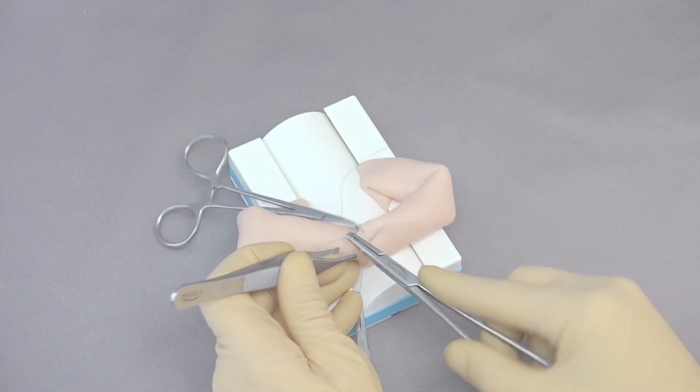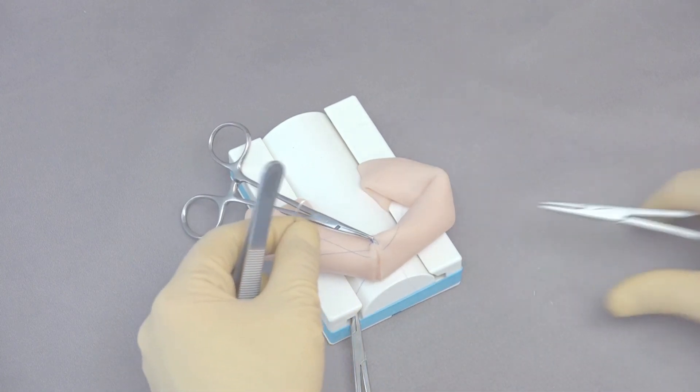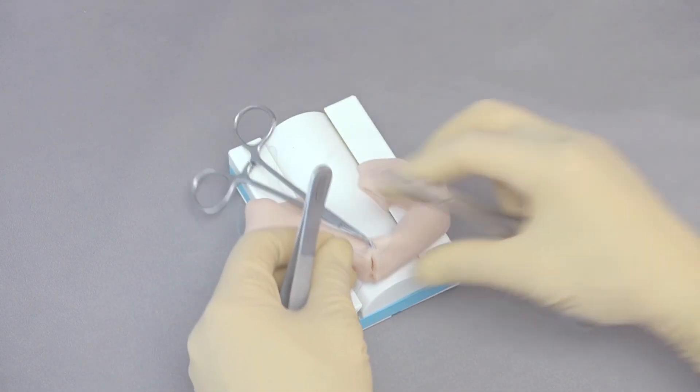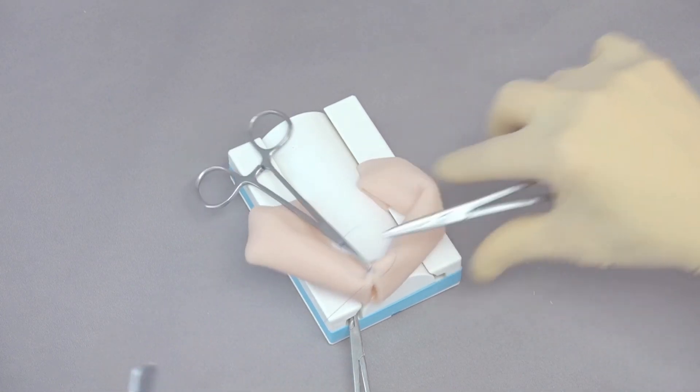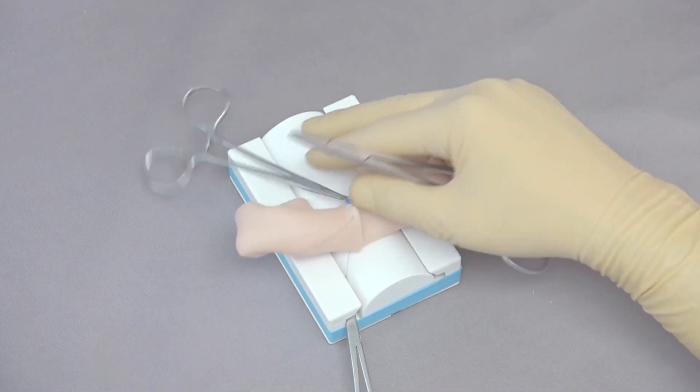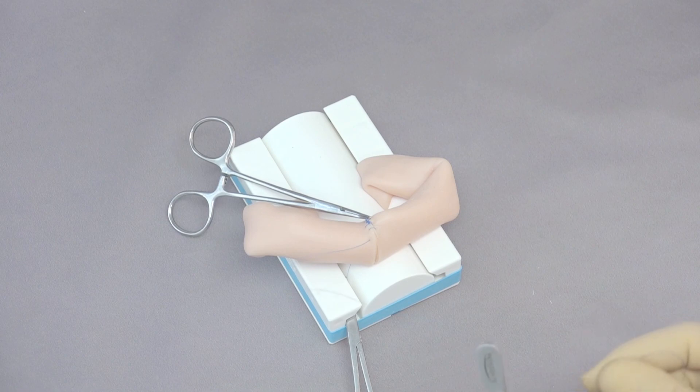Again I'm going to stick the needle thumb forceps inside to stabilize the bowel. Now that I've started down here I can usually get both sides at once. Making sure that I don't have a locking suture, come through and tighten this down. I'll just go ahead and finish the rest of this side.